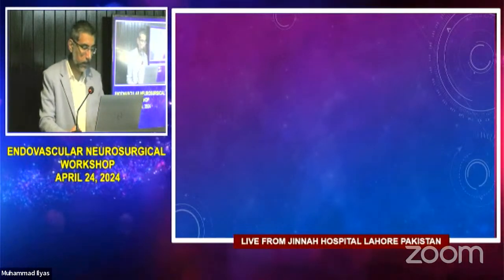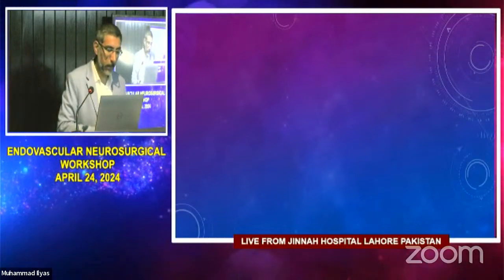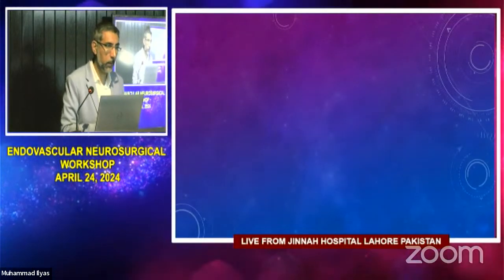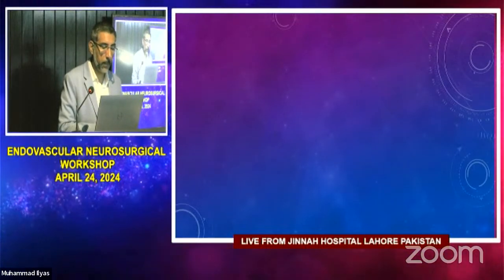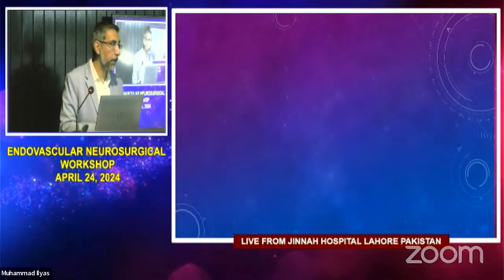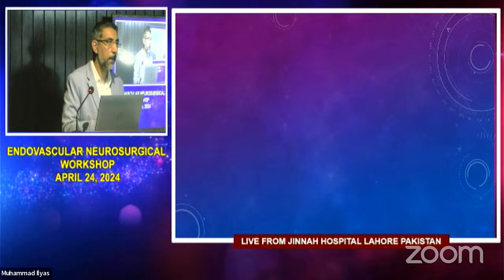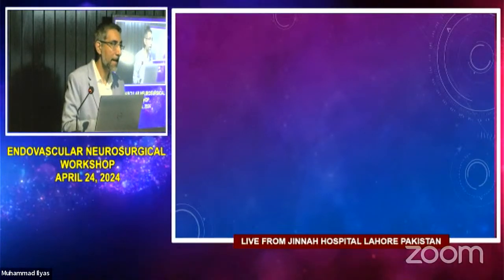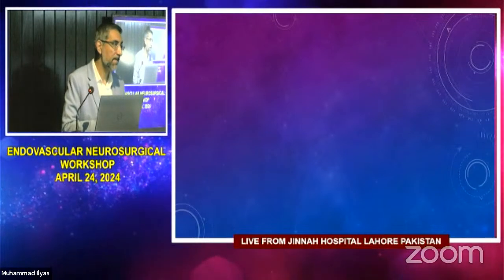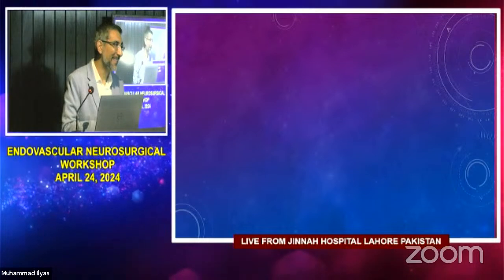But the next slide I'll show you when it comes up is, I'm sure you see carotid cavernous fistulas here all the time, right? And so when I started training, pretty much the only option to treat CCF. So let me ask you, how do you treat CCF here? It was just carotid ligation in the early 19th. Yeah. Would do the carotid ligation. Right. Now it is referred to endovascular. Right.